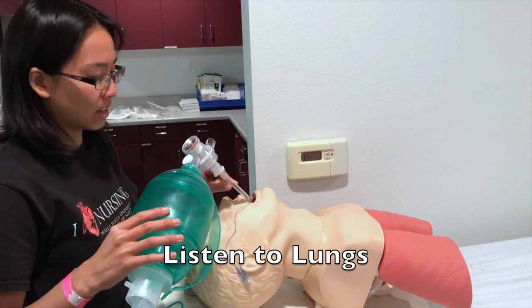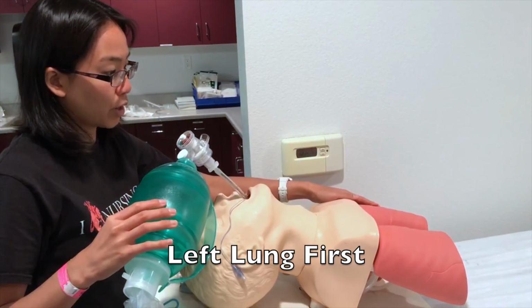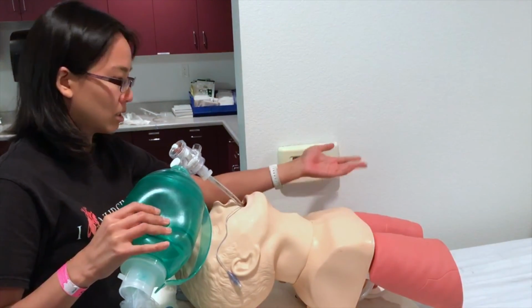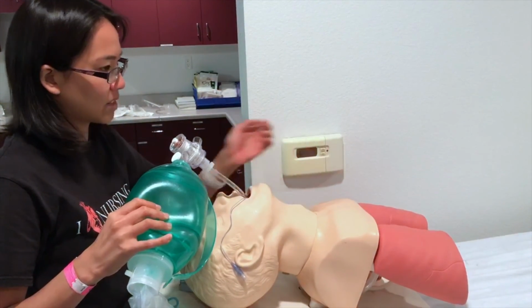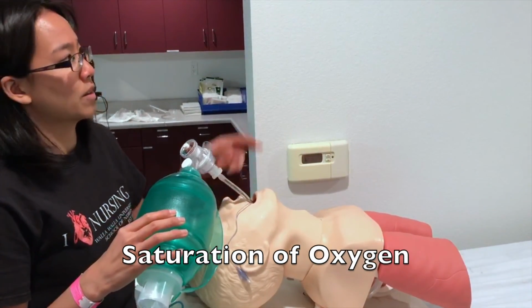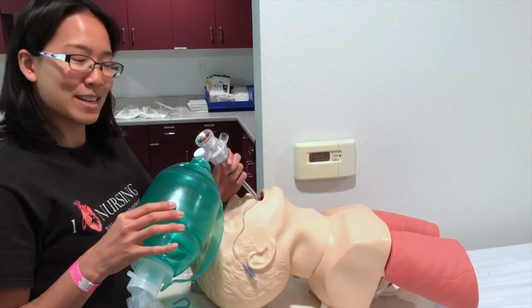L stands for listen to lungs. So you want to listen to the left side. You want to make sure you don't do an endobronchial intubation where it's just the right side intubation. So as you can see, it's a very clear view that it's bilateral breath sounds. And then the last S is O2 saturation. So again, you want that to be an appropriate number as well on the monitor. That's how you tell if you intubated someone appropriately.